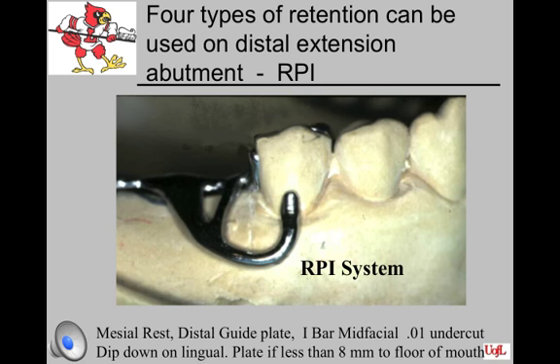It is an infrabulge clasp, so it approaches the tooth from the apical direction. It turns upward in the form of a curved right angle at the middle of the tooth or slightly mesial to the middle of the tooth. It engages the .01 undercut and then extends upward to the survey line. It contacts the tooth in the form of a pad that is a minimum of 2 to 3 millimeters in height, occlusogingivally.